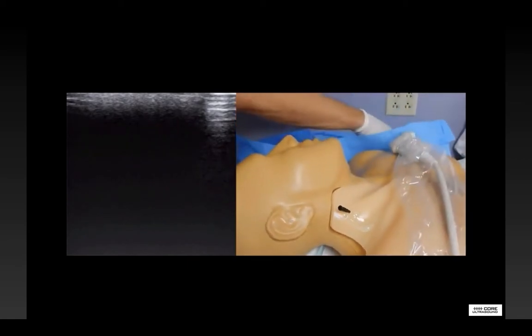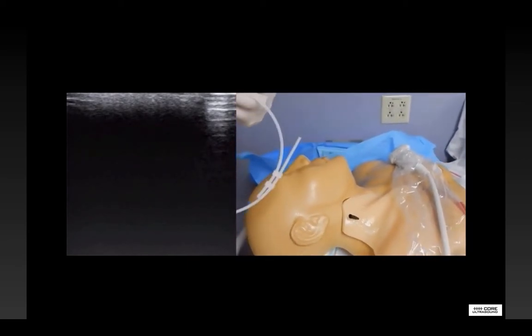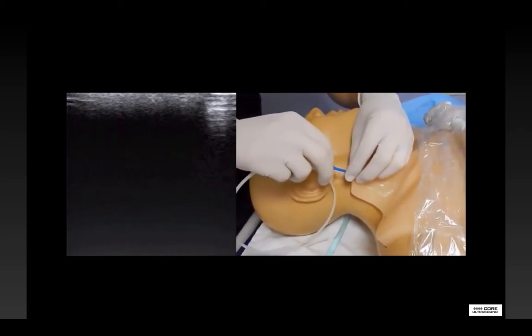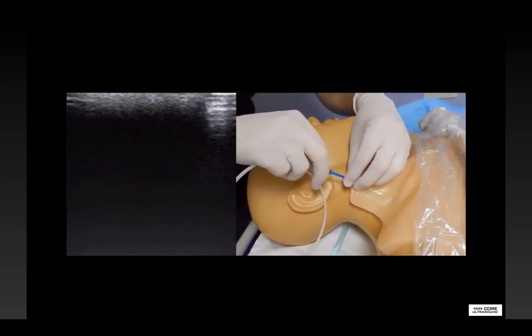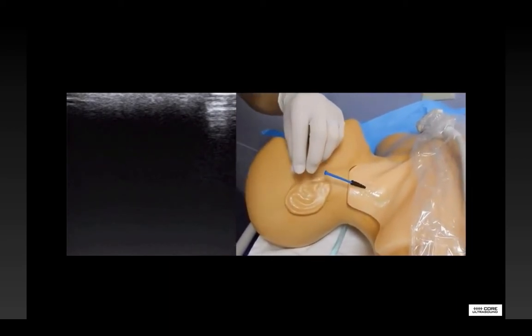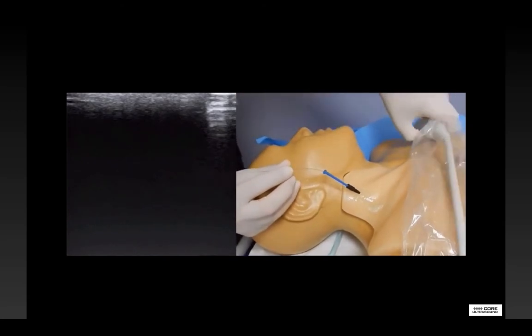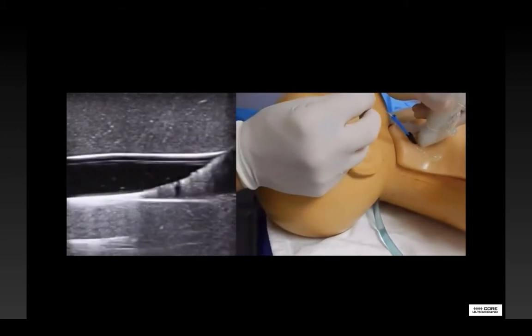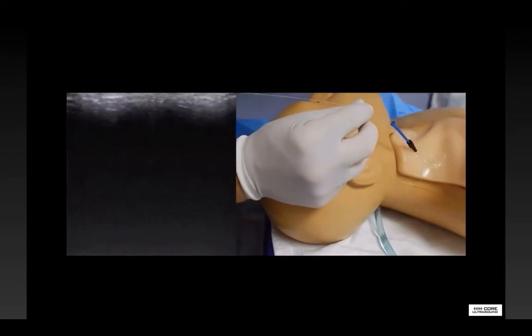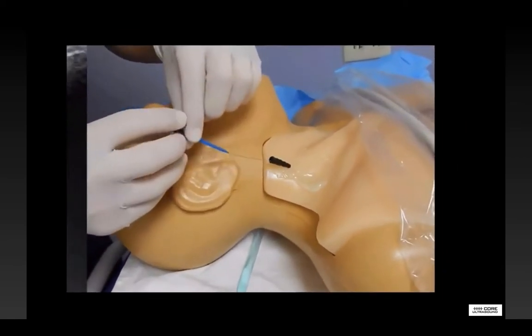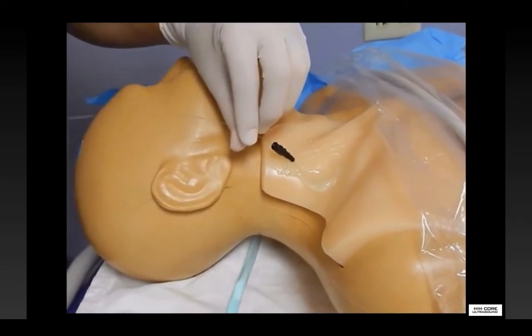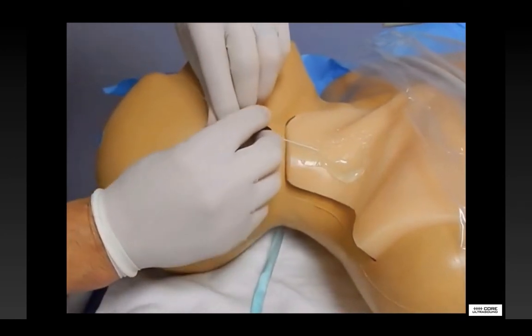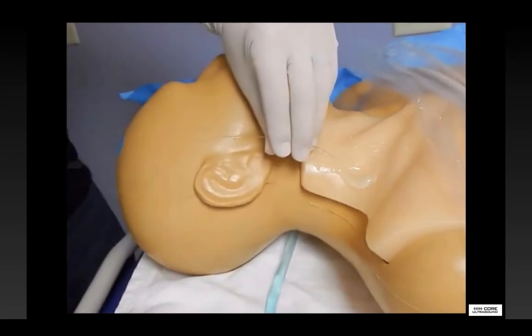This can be left as what some call an easy IJ and used as access itself. To move to a central line, we then place a wire through the catheter. You'll see the provider then uses his probe in an in-line approach to visualize the wire within the vessel lumen. Once the wire is in place, the catheter can be removed.